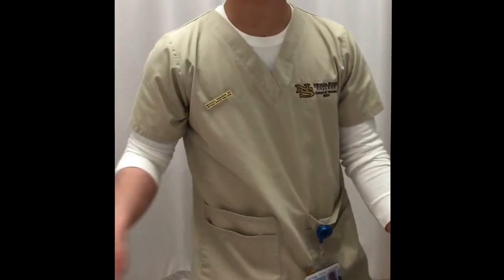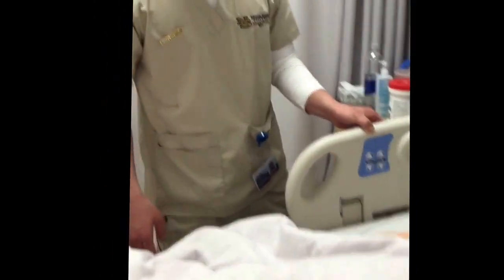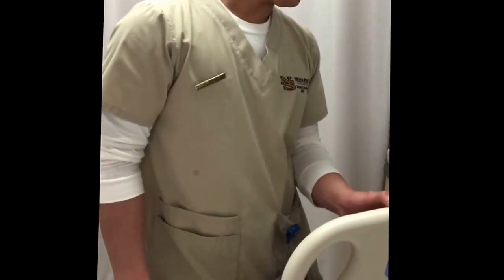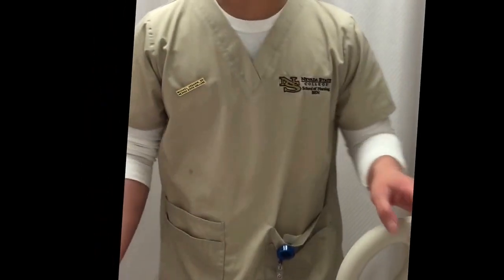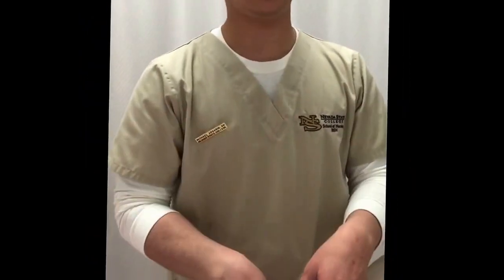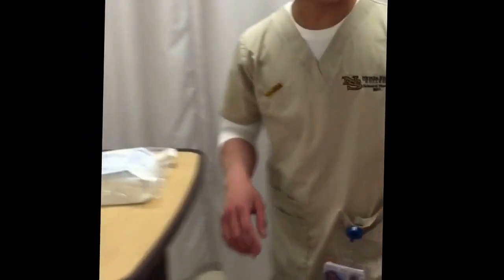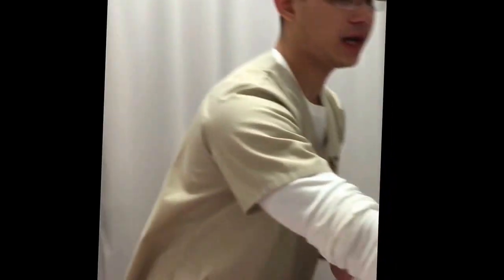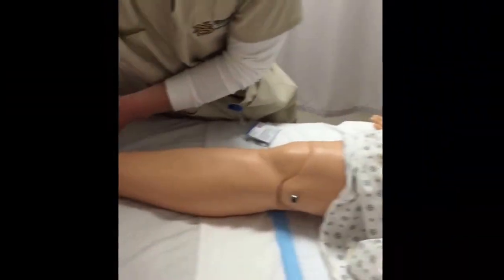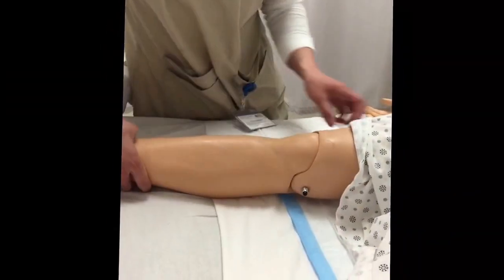So make sure that the bed is on the same level as you, where you can work comfortably. All right. And if you have an extra blanket, when you take this off, make sure you put a blanket on for privacy and warmth for your patient. Alright, so now let me just take this off, okay? And if you have a blanket, just put a blanket on top of her.